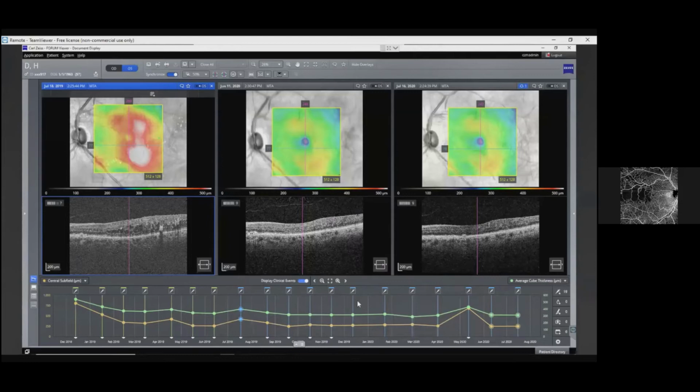It's also, I think, helpful when you're seeing other people's patients, right? We sometimes see our partner's patients, and you're wondering, well, what's the appropriate interval for this patient, and why are they at this time frame? You can quickly pull this up and see where they've had recurrences and where their best interval is if we're keeping their maculas as dry as possible. So I think that's a really nice analysis to use, and I think very helpful. So something I use in my practice every day. So that's patient DH.